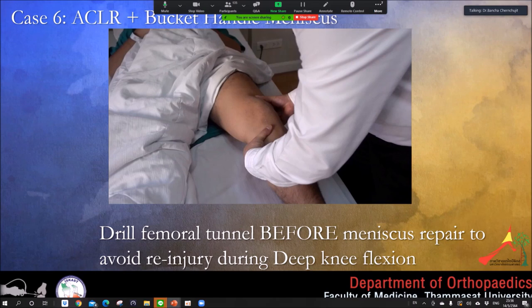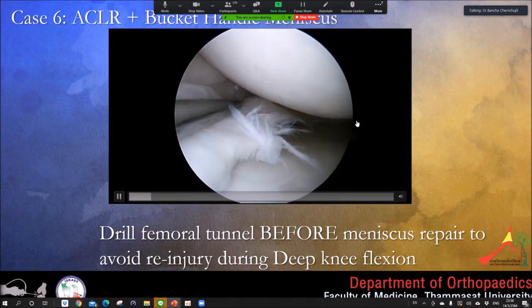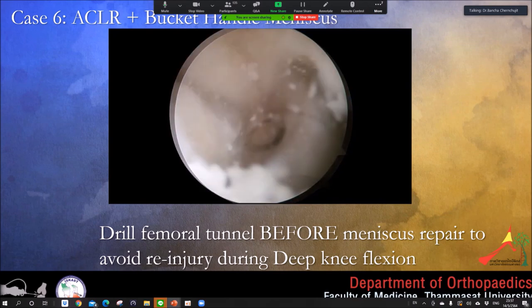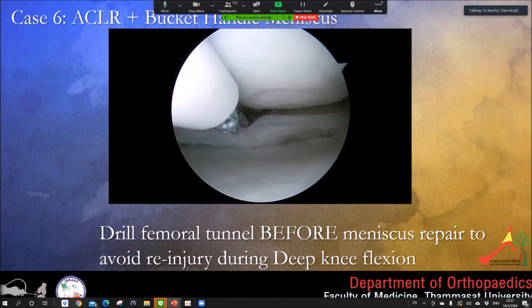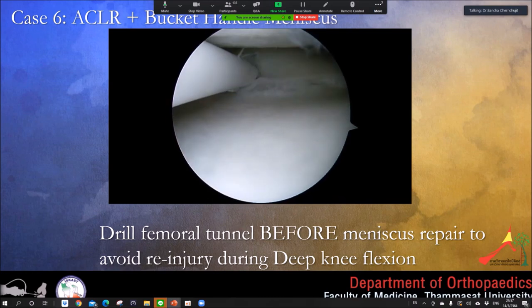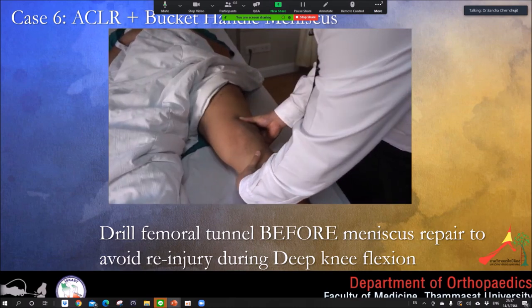An important point: when performing ACL reconstruction together with bucket handle repair, do not repair the meniscus first. Do the femoral tunnel first, then come back for the meniscus repair. If you repair the meniscus first and then drill the femoral tunnel, you need deep knee flexion — and you will tear your meniscus repair.